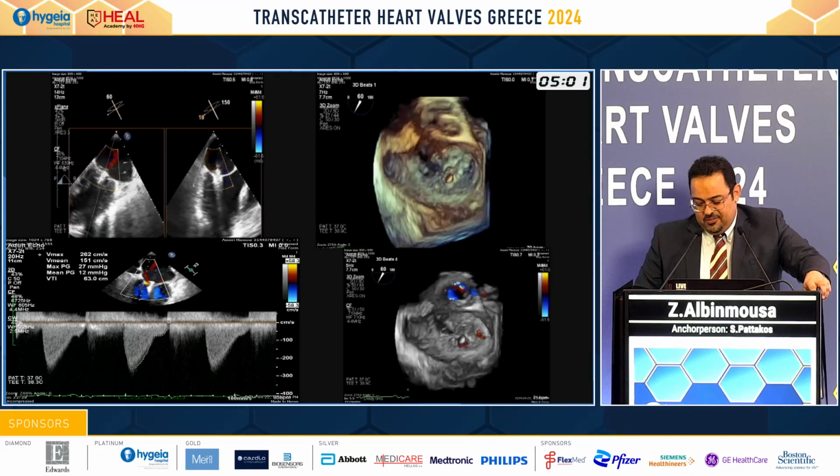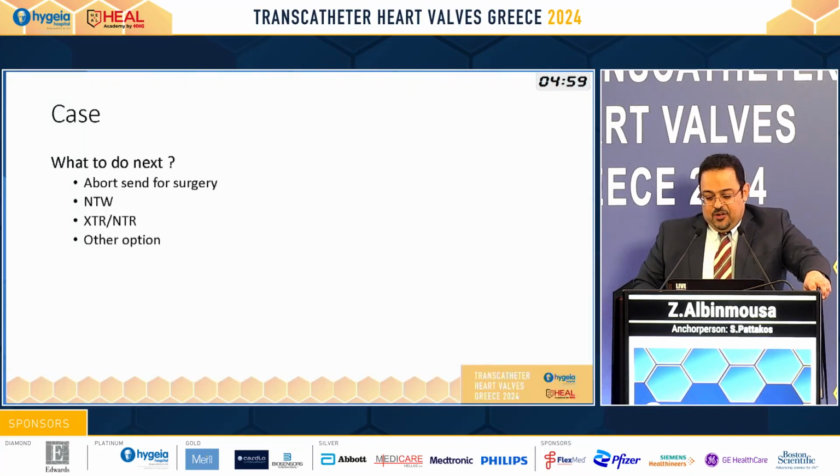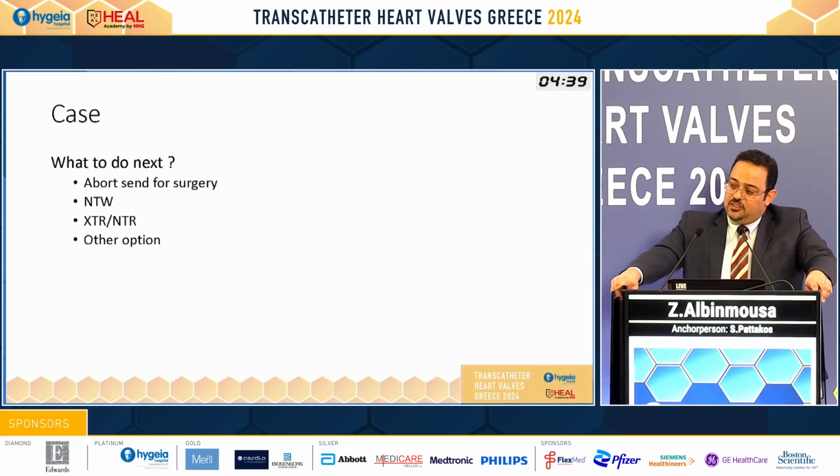So now the discussion was very hot in the cath lab about what to do. The options we were discussing: abort, or send for surgery. The surgeon said, no, I will not take him. Then the other option, as I said, is percutaneous mitral valve replacement, which was not available in that facility.